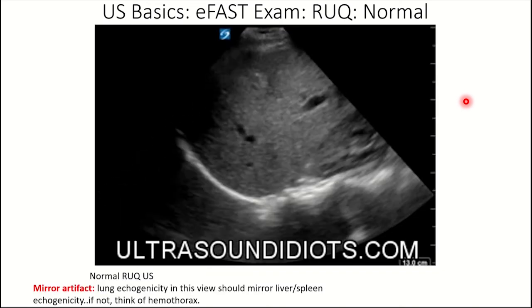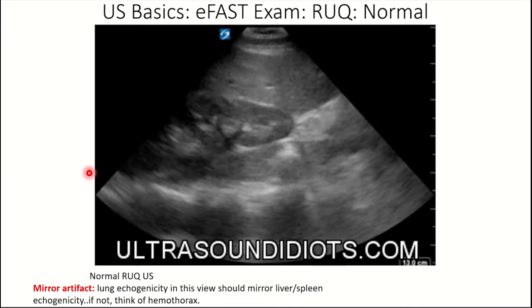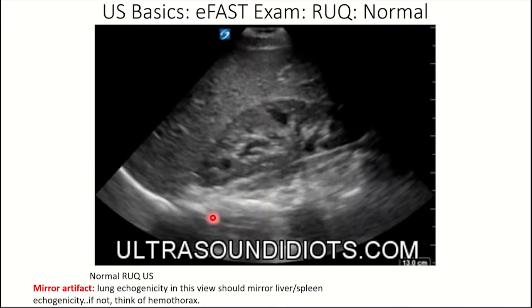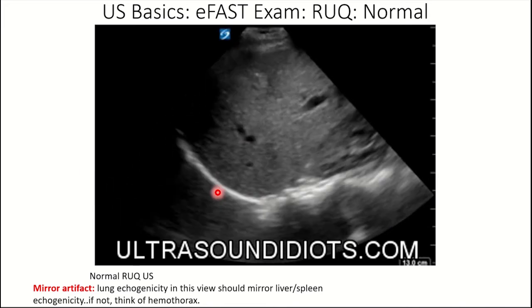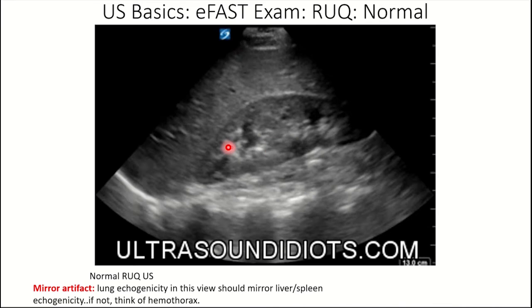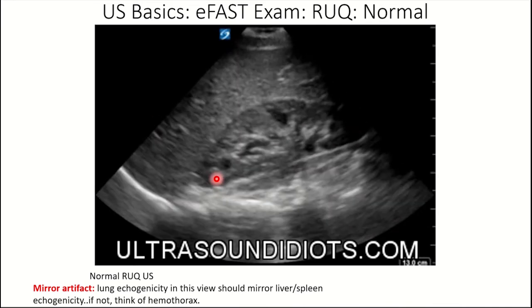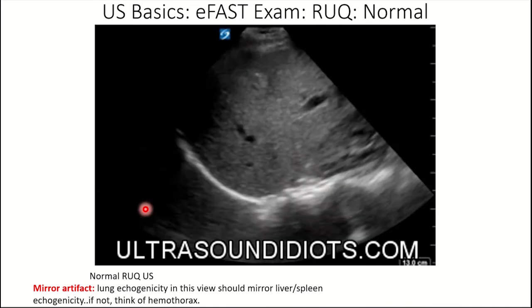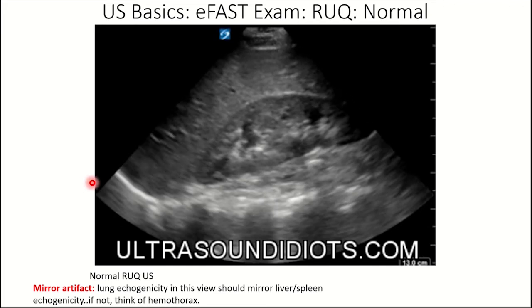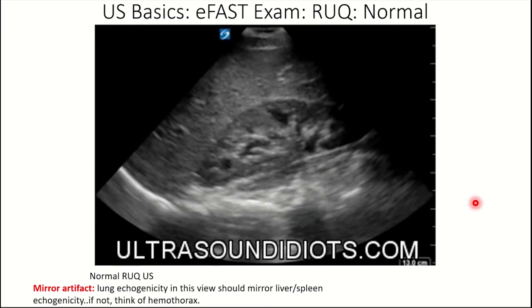Here is a normal RUQ image in motion. We can see the diaphragmatic stripe in white, the lung, the liver, the kidney, the hepatorenal space, and the inferior pole of the kidney. We also see the mirror artifact — the lung echogenicity should mirror the liver and spleen echogenicity. If it doesn't, think of hemothorax.